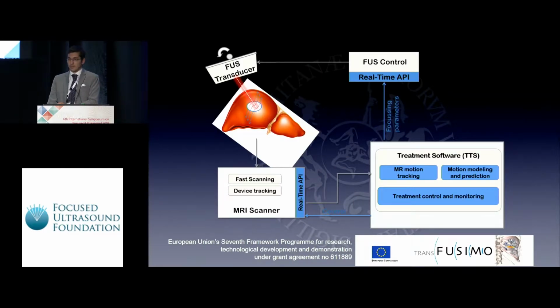This is the TRANS-FUSIMO working treatment software. It's much more complex than that, but this is at the physician level, so at my level. We have a workstation that allows us to take full control of the MR for both planning, device tracking, and of course pre- and post-treatment imaging. On the other side, this workstation is connected with a focused ultrasound system and allows us to control each single sonication parameter.